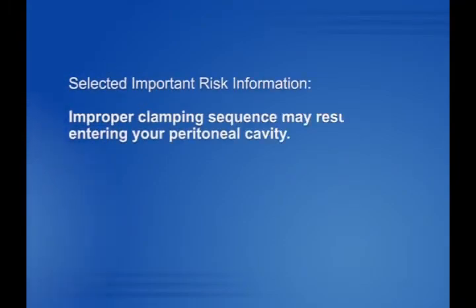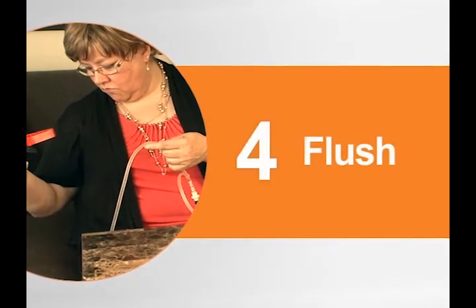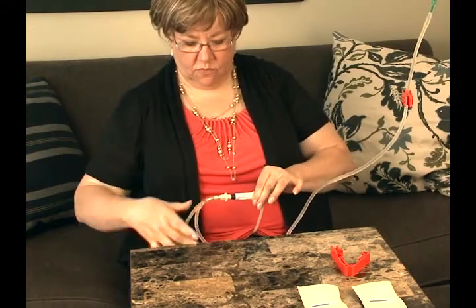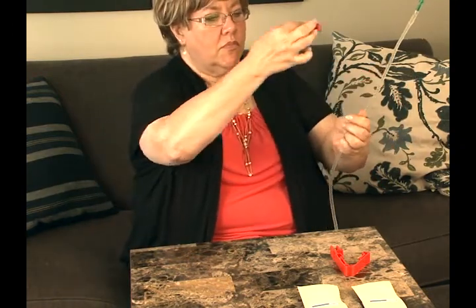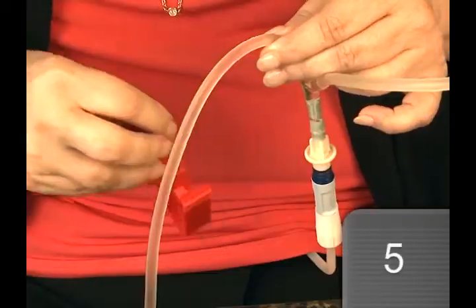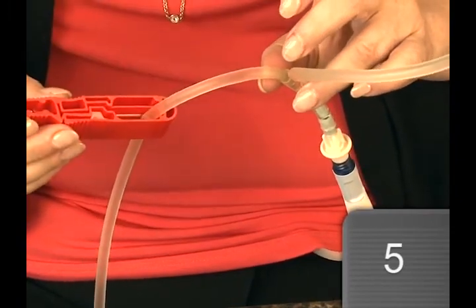Important risk information: improper clamping sequence may result in air entering your peritoneal cavity. Let's proceed to the flush step. First, make sure your transfer set is closed, and then remove the UltraClamp tubing clamp from the fill line. Count to five slowly and let the new solution flow into the drain bag. Then clamp the drain line with the UltraClamp tubing clamp.